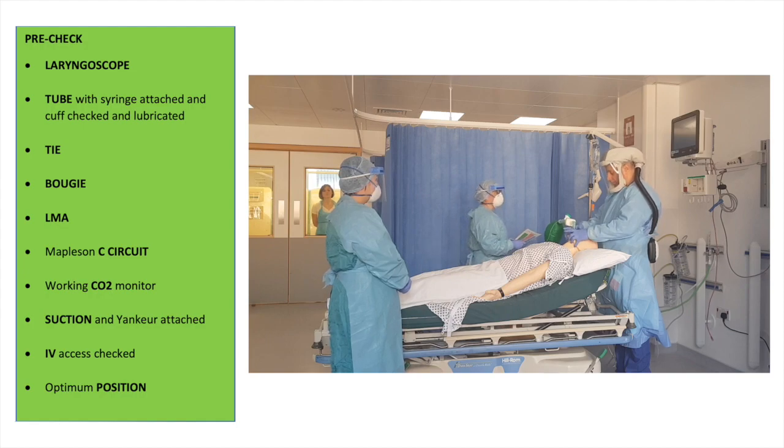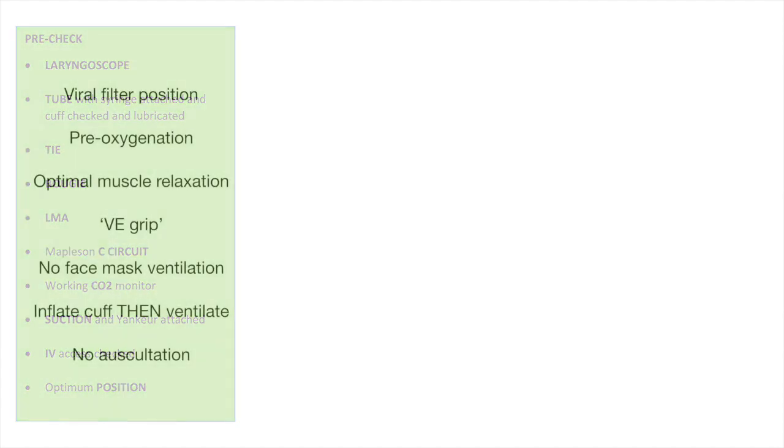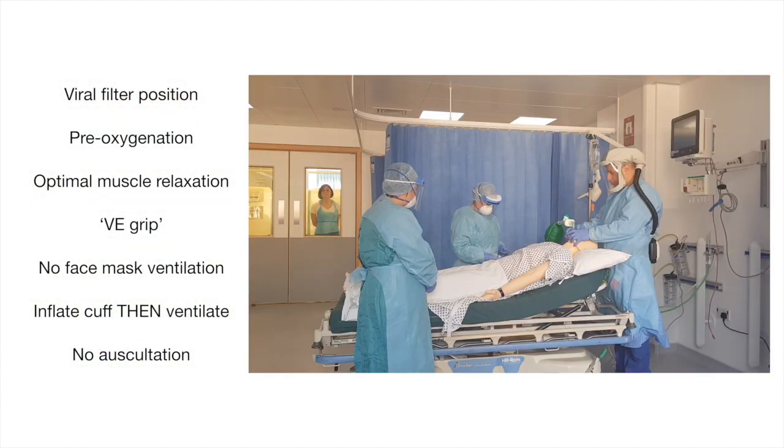Are you happy with the position? Okay, are we happy to proceed? Please. Okay. Okay, so we're going to go to sleep. Right, Mrs. Smith, I'll start getting you off to sleep, okay?